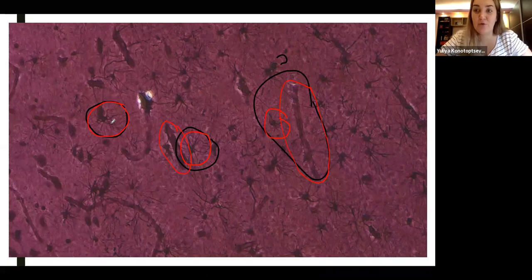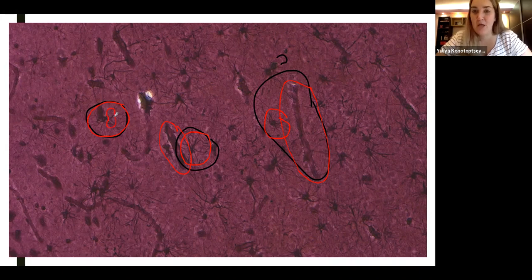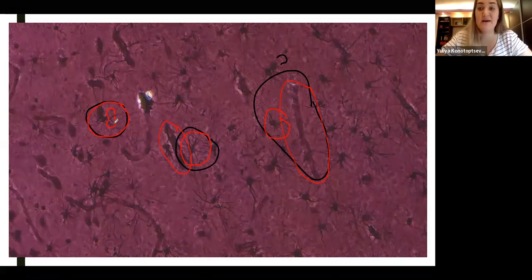How do you know that they're protoplasmic? Because they're branching. Very good. The processes are short. Do you see? They're relatively short. And there's lots of branching happening. Because these are protoplasmic astrocytes, is this slide from the cortex or medulla of the brain? Cortex. Cortex, because cortex is the gray matter and protoplasmic astrocytes are located in the gray matter.